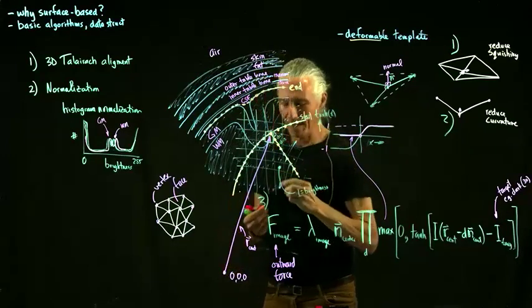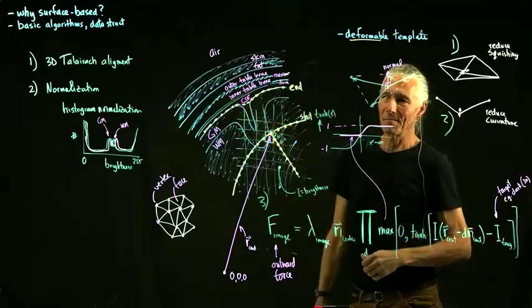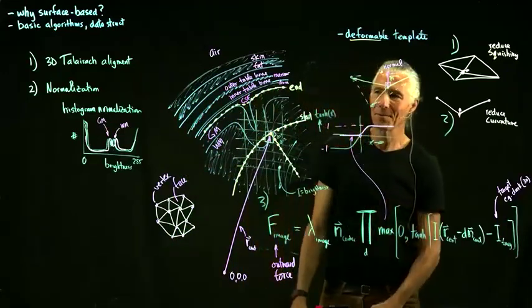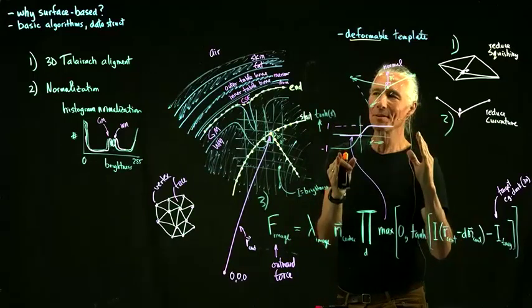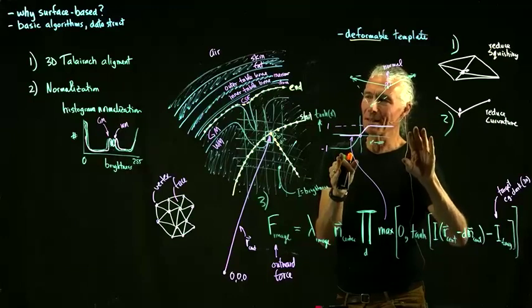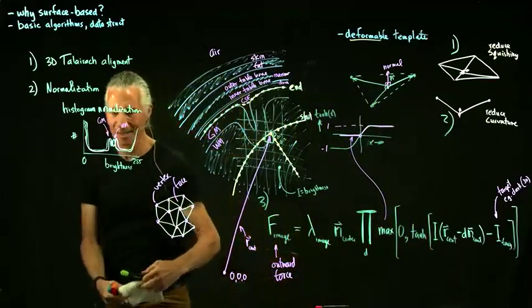So now, on a computer, you can do that. It takes like a couple seconds. And then you can quickly strip off all the rest of the stuff that's outside here. So that just gives you some idea. Now, you might think, why don't you just do it manually? Well, it takes longer than you think. You'll end up with like 200 slices, and you've got to edit 200 slices. So you could do that, but if you want to do a reasonable number of brains, that will end up taking weeks, whereas you just have a couple seconds of computation. So now we've gotten rid of the skull.